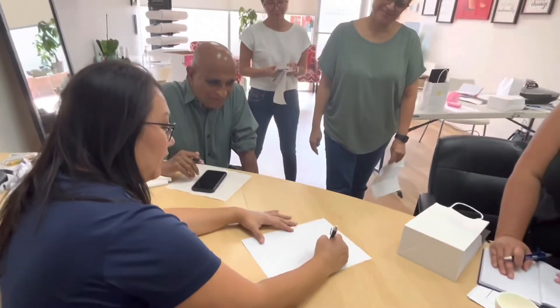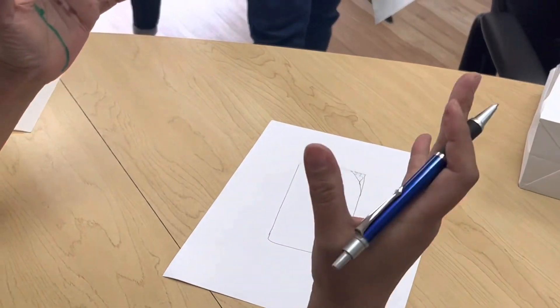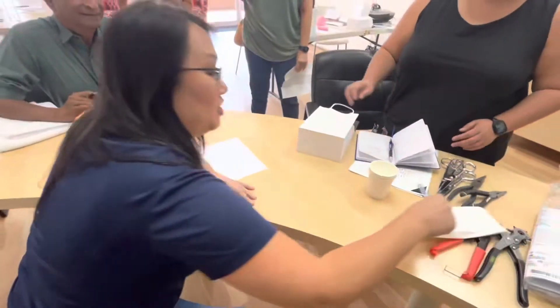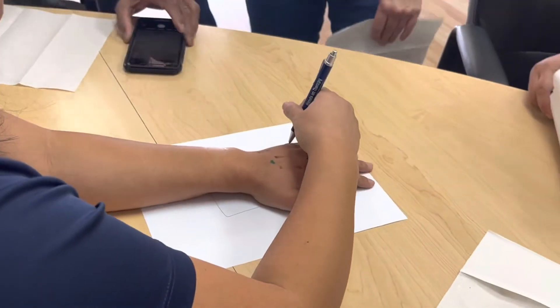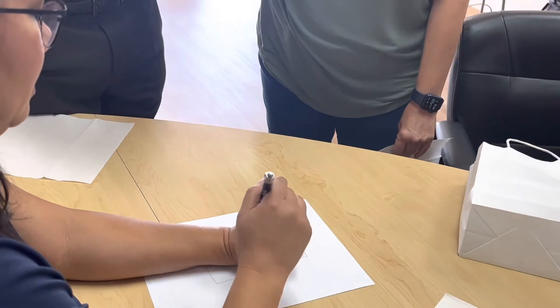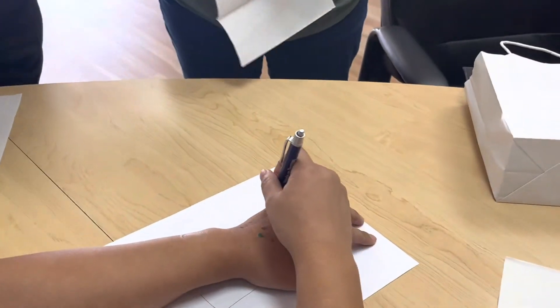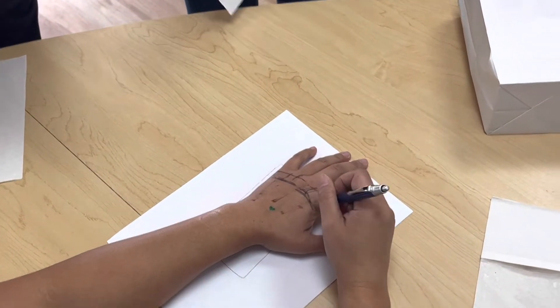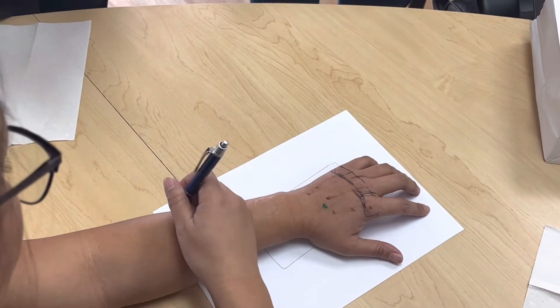You really don't need a pre-made pattern too much. If you're trying to make a radial splint, the splint material needs to sit below the MP joint so it can come up. The principle is the length — the length has to be two-thirds the length of the forearm.